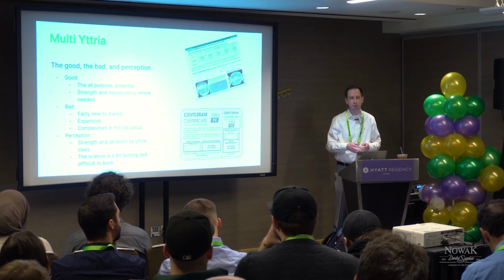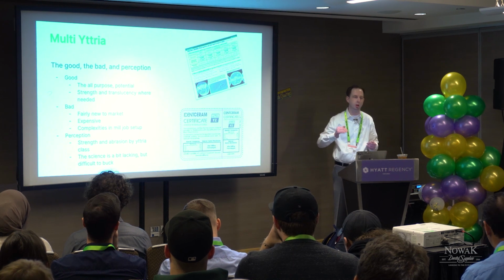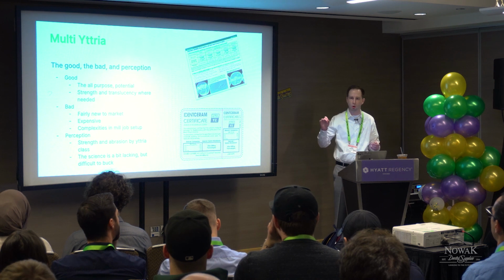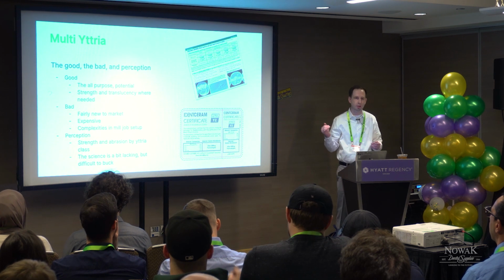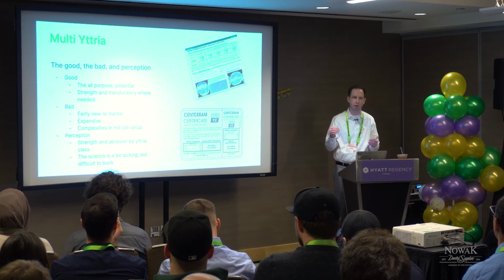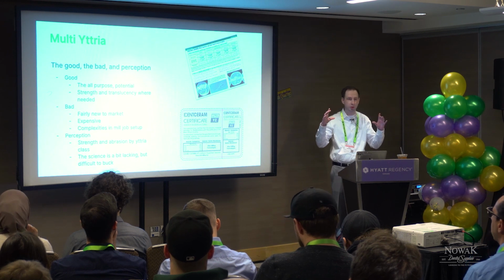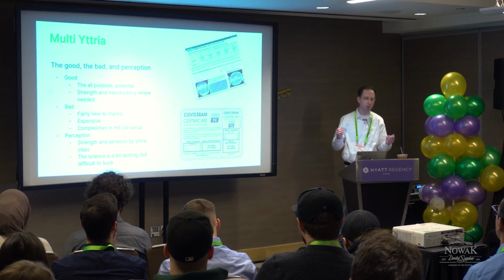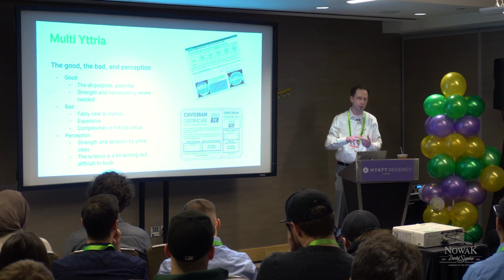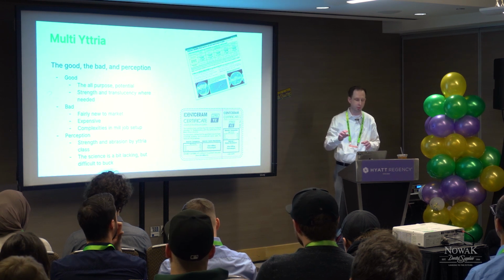And then there's complexities of mill setup. I mentioned this is multi-chromatic, which is important. You want to make sure the transitional color looks natural, but it's even more important with multi-yttria because you don't want the tail end of a bridge leaving that 3Y zone when you think you're getting full 1200 megapascal strength. So the way the part is positioned becomes even more critical. These are just process considerations, and you really have to have good standard operating procedures around these things, especially with these multi-yttria, multi-chromatic materials.